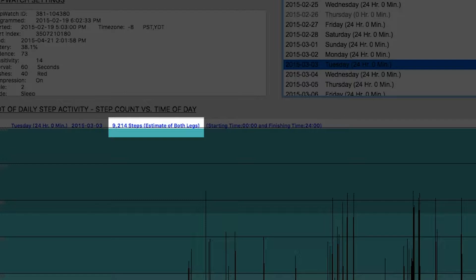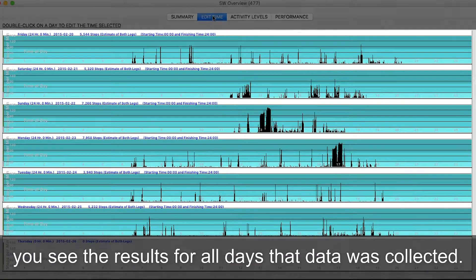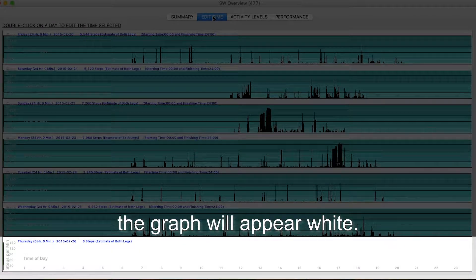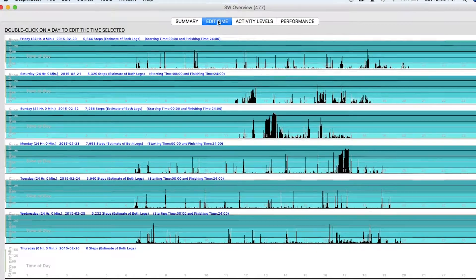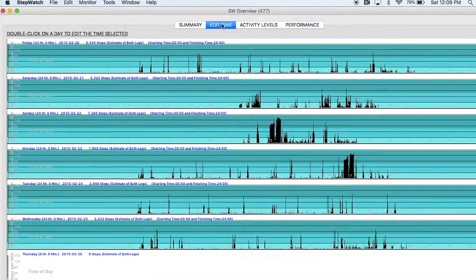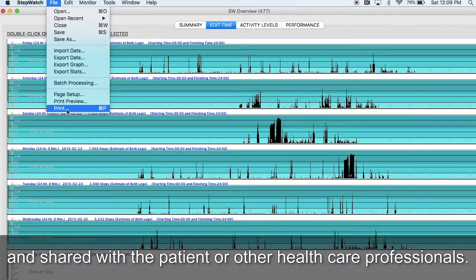Settings can be adjusted for displaying steps for one or both legs. Under the Edit Time tab, you see the results for all days that data was collected. On days when there was no activity, the graph will appear white. This graphical display is intuitive and helpful when discussing the results with the patient. Here you can see wear patterns and times of increased or decreased activity. This screen can be easily printed and shared with the patient or other healthcare professionals.